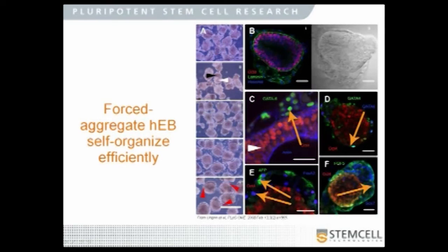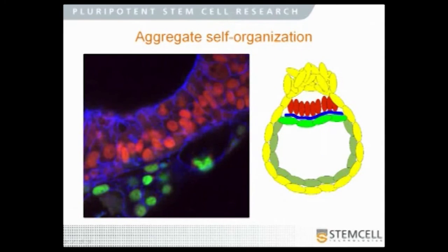And just to bring the point home a little bit, comparing that to this model of early human development that I showed in the introductory slide, you can see again we're looking at columnar morphology overlying, not stained in this particular photomicrograph, but the laminin-containing basement membrane is here, and then markers of visceral endoderm here. So I would argue that this is a model of the epiblast stage of human development, which is something obviously of significance both from a developmental biology and tissue engineering viewpoint.